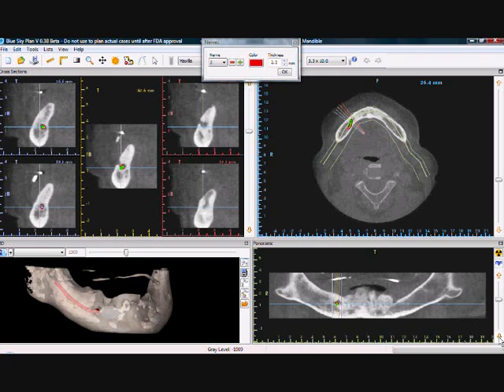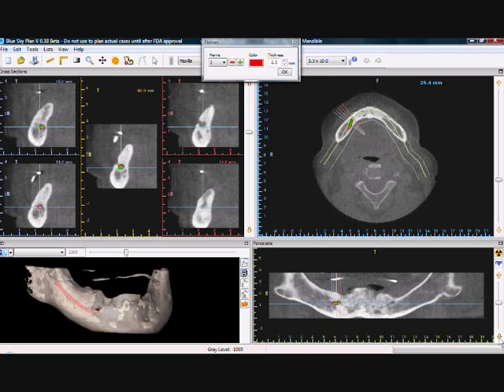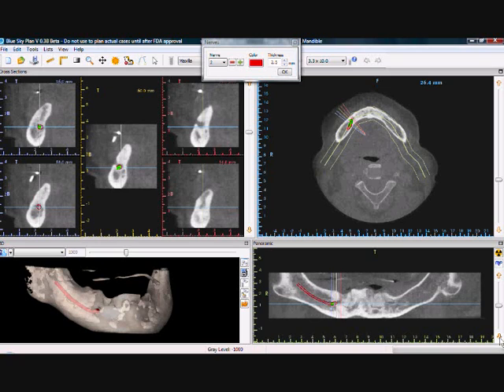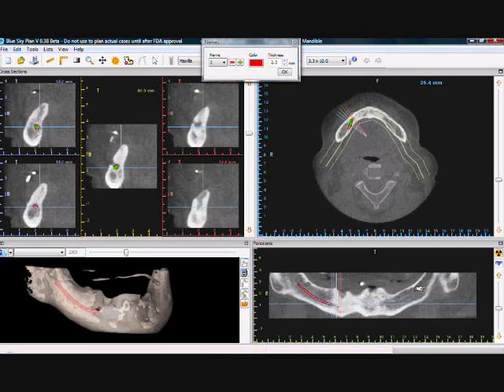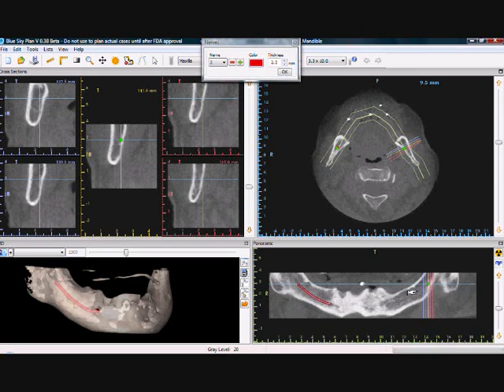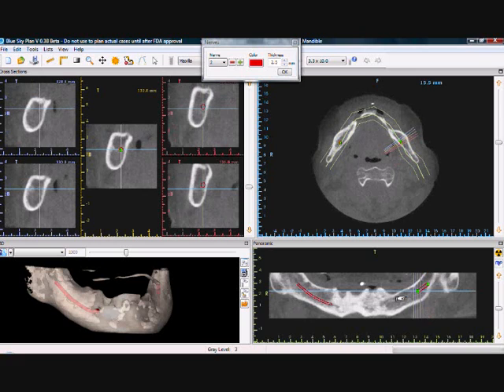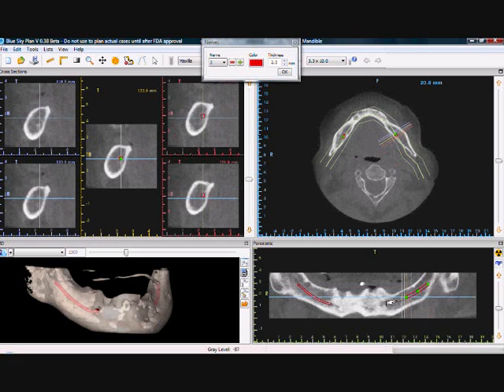Once again, we should find an appropriate panoramic slice that clearly displays the nerve, and we can start drawing the nerve by placing the dots along the nerve canal.